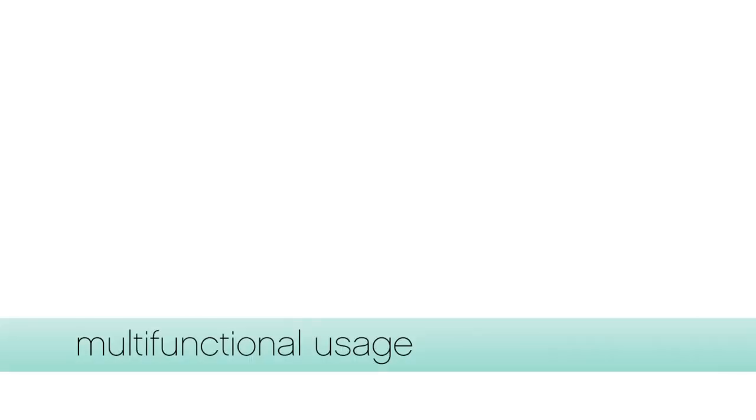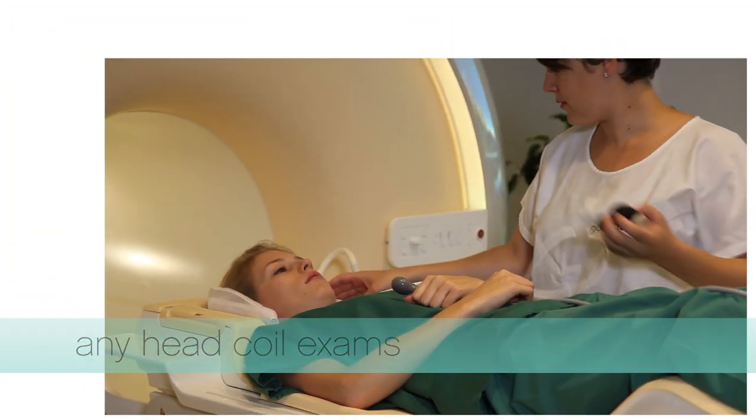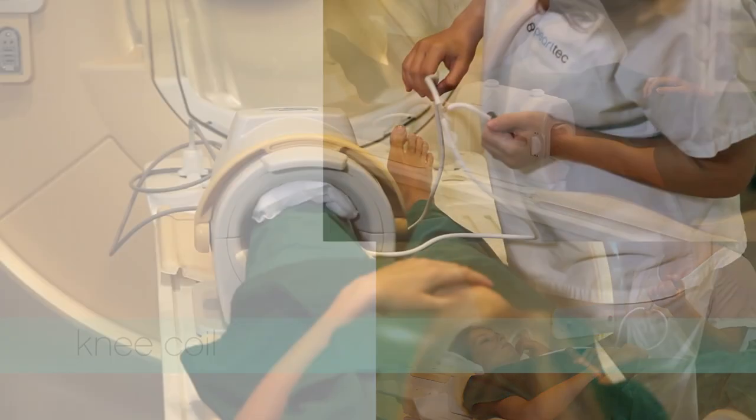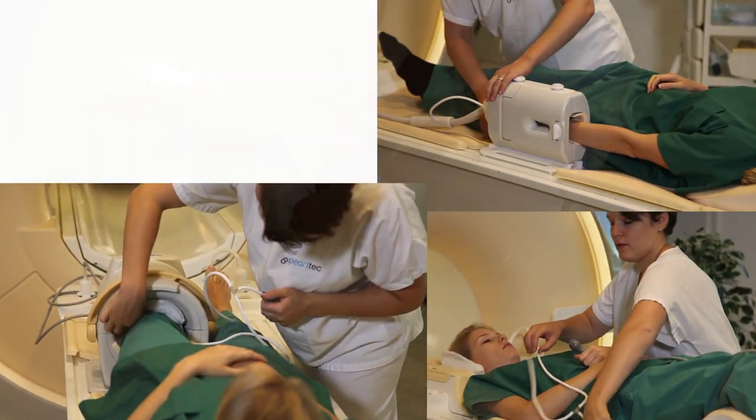The multi-pad product can be used in a wide range of MR and also CT exams. Here are a few examples of the exceptional versatility. The pads can be used in any head coil exam, in hand exams for finger stabilization, in knee coils for leg stabilization, or in setups for foot examinations.